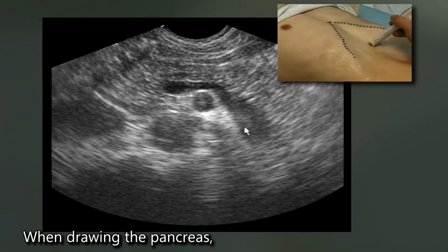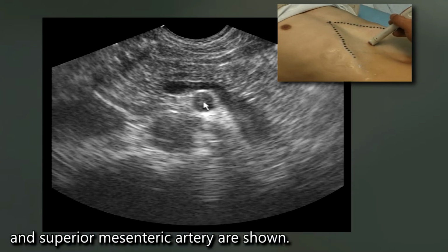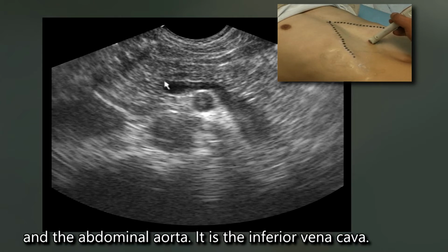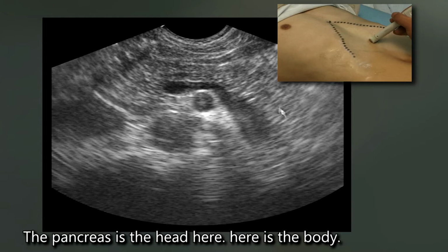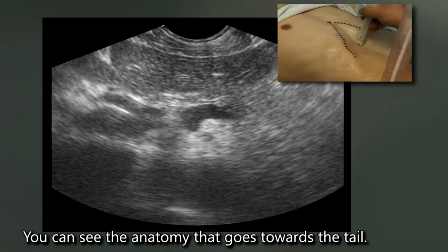When scanning the pancreas, the most important thing is the splenic vein, and here the superior mesenteric vein and superior mesenteric artery are shown, and the abdominal aorta. This is the IVC. The pancreas is the head here. Here is the body. You can see the anatomy that goes towards the tail.